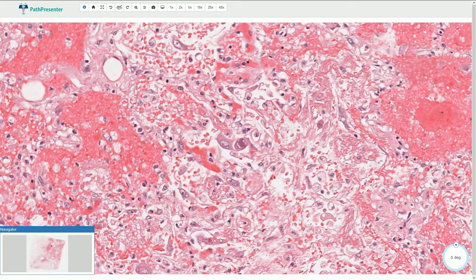Cytomegalovirus can infect multiple subtypes of lung cells, including pneumocytes, endothelial cells, fibroblasts, and also macrophages. Sometimes we can also find intracytoplasmic viral inclusions, however they are smaller and much less prominent.